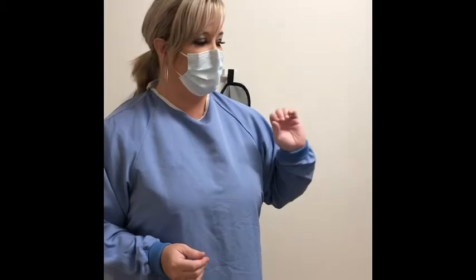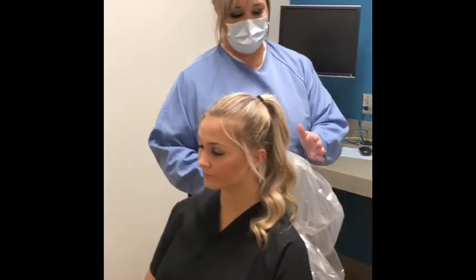If your patient was wearing eyeglasses, you want to remove those. You want to ask if they have any removable retainers, appliances, anything like that as well prior to taking your x-rays. All right, so now we need to get her positioned.